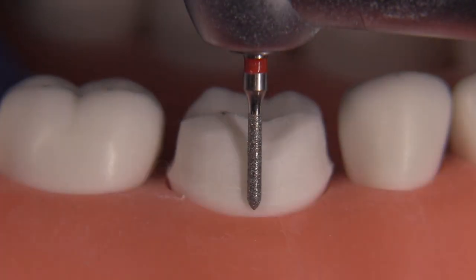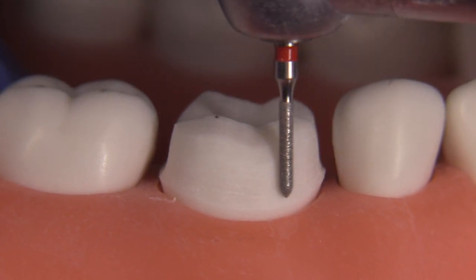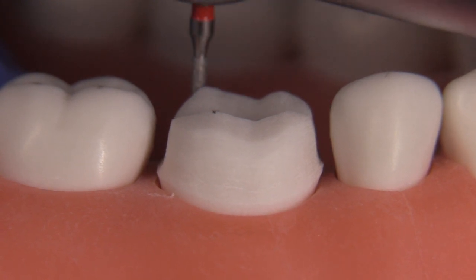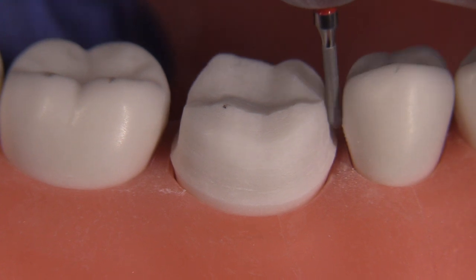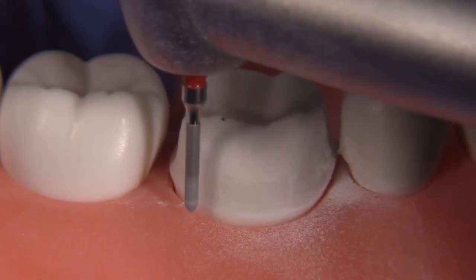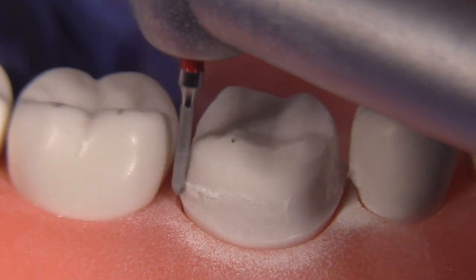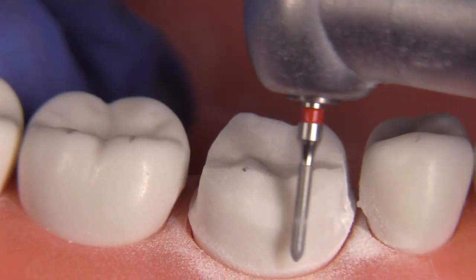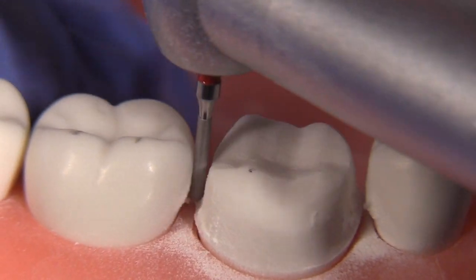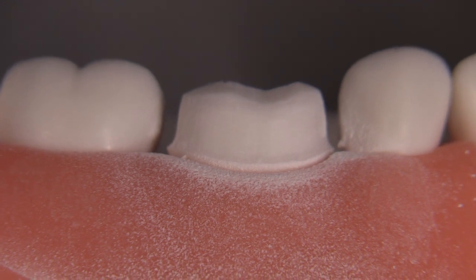You don't want to prepare that facial surface with just one plane — it's got to have two planes. When we move on to the chamfer refinement step we utilize the 8877009, which my students have always called the 'chamfer fixer' because it does such a great job making your chamfer ideal, with it declining at about 60 degrees. I'm sometimes discouraged when I see chamfers that look more like shoulders — they don't have that declination angle and don't allow you to have a metal seal, a slip-joint effect.